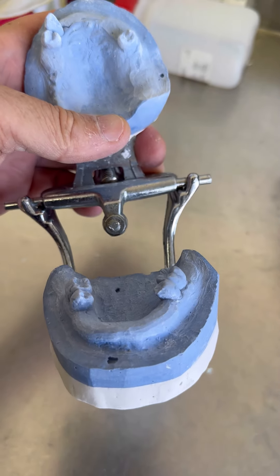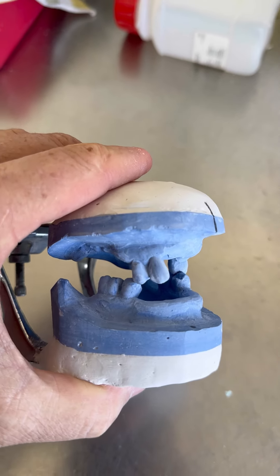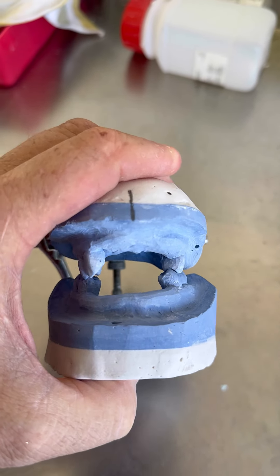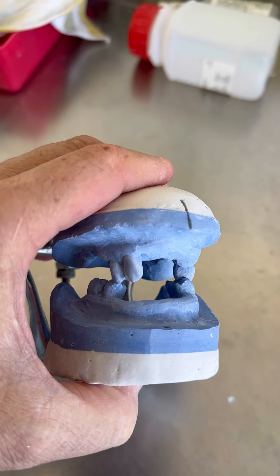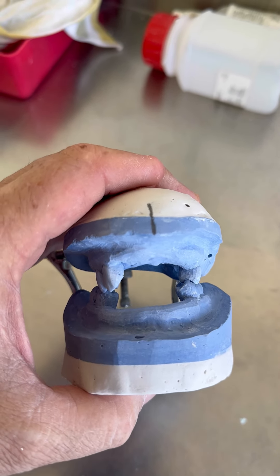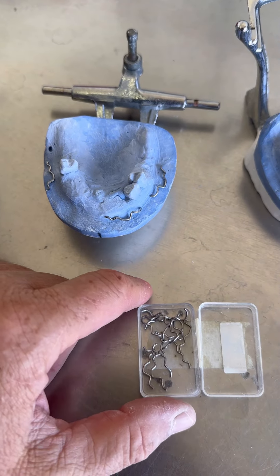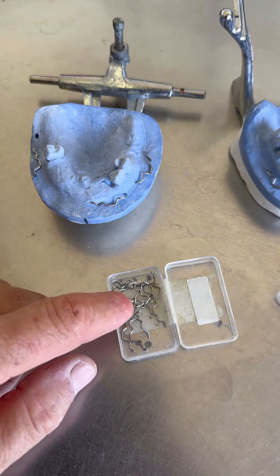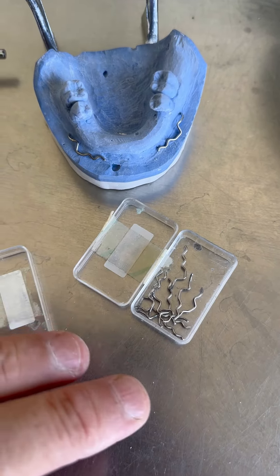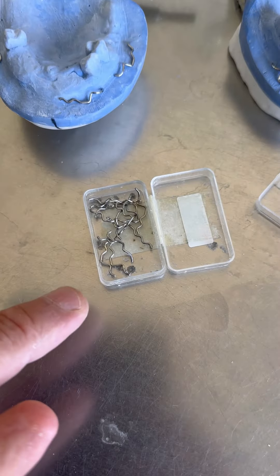Будем ставить сейчас крючки. Покажу вам, как она будет потом с крючками выглядеть, а потом буду ставить уже зубки. Цвет зубов А1 — белые зубы. Наверное, человек эфиоп. Вот что хочу показать: я даже эти крючочки заготавливаю впрок, когда есть свободное время на работе, чтобы потом не тратить на это время. Вот они — одни левые, другие правые.